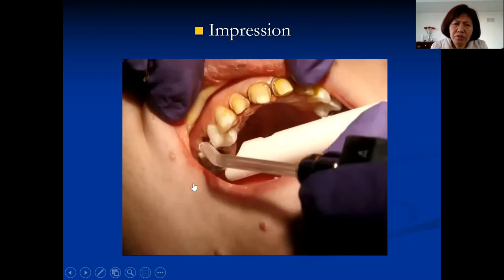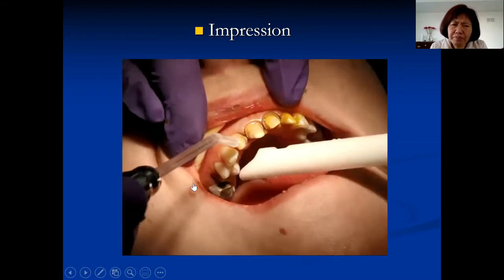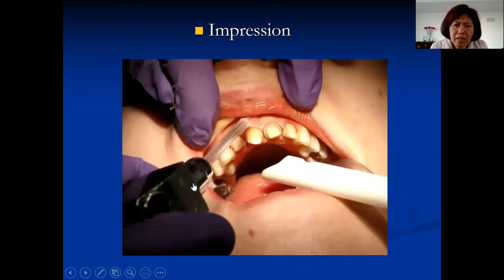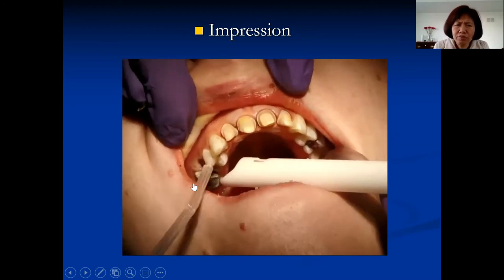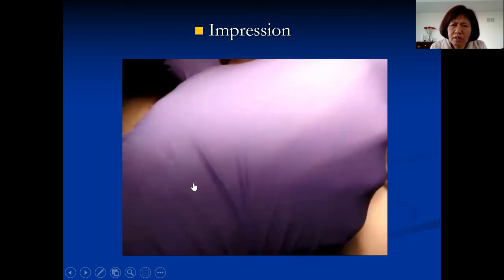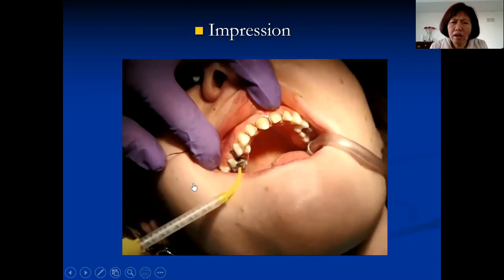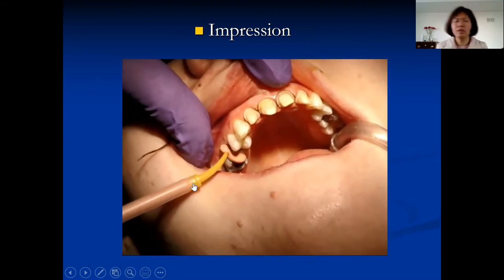Once the cord is out, rinse, double-check, and confirm there's no bleeding. If you do have bleeding, don't take the impression — you won't get a good result. Quickly pack another cord soaked in viscostat or hemodon; the bleeding will usually stop when you remove it. If a patient has very difficult-to-control bleeding, I will use lidocaine with more epinephrine, inject at the lower cord area, then pack the cord one more time. Press only lightly — make sure the cord is soaked with hemodon — then remove it and the bleeding will stop.